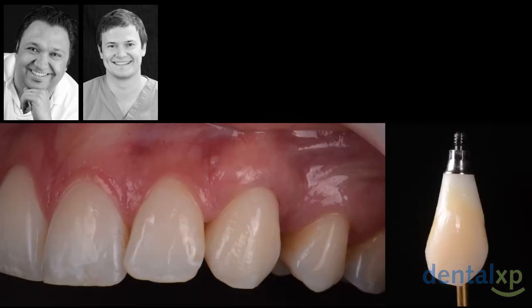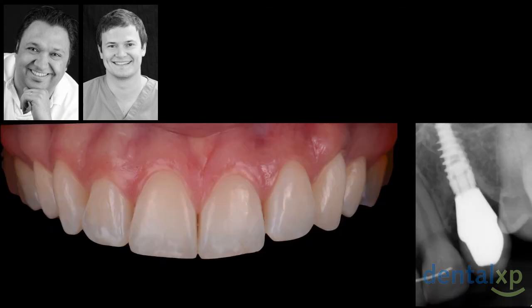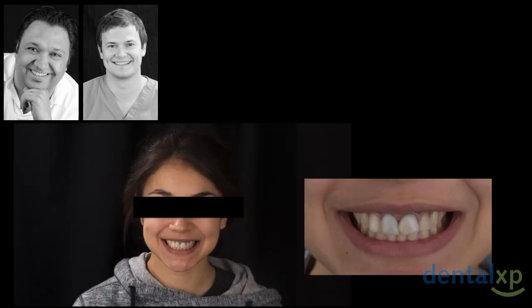We finished the crown afterwards, and this is a full zirconia crown that has ceramic veneer layered on it, with an angulated screw channel to manage exactly the screw channel in the palatal, but that's another topic. And you can see here the final result. And we have a very happy patient with a very simple and very predictable workflow also. And that's the whole point of this workflow. It's to be predictable, really quick, and to be able, in one consultation, to plan for surgery and for provisional restoration.